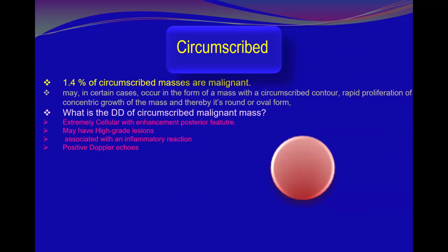As we mentioned on mammography and in other lectures, 1.4% of circumscribed masses are malignant. Do you remember that? Yes. What is the differential diagnosis of that?